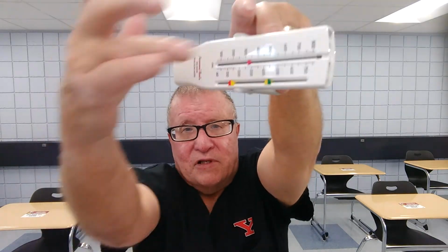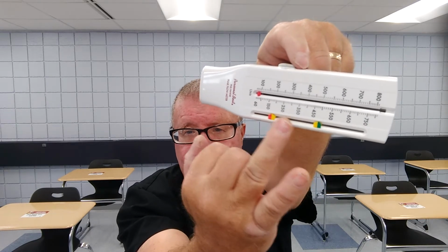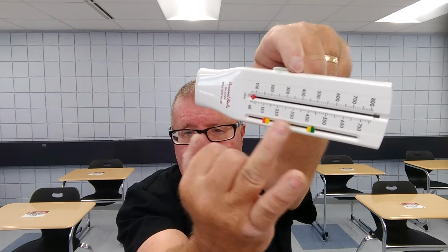Now, to do one of these, again, the red thing, I'm going to move all the way down to 0. Don't pay attention to these things down here. These are your red, green, and yellow zones, which you set later, okay? So don't pay any attention to that. What I do is have the patient breathe in to total lung capacity, which means as much air as they can. And again, you really have to coach the patient. You want to yell at them and have them blow as hard and fast as they can. So they'll take a deep breath in, put it in their mouth, and blow as hard as they can. Looks similar to this. Deep breath in.